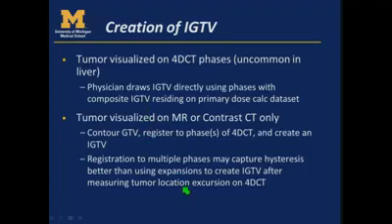This can cause some problems if you're just doing, say, a certain expansion, sup and inf, and another expansion, ant to post. You may miss some hysteresis, so given the tools that we have in our planning systems to create ITVs, it's really important that you watch the 4DCT movie and make sure that your ITV is really well encompassed within the margin that you've created.